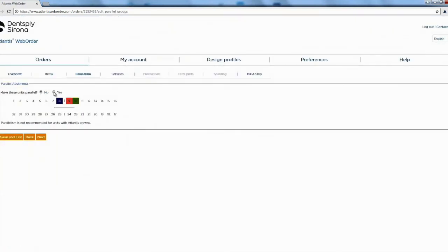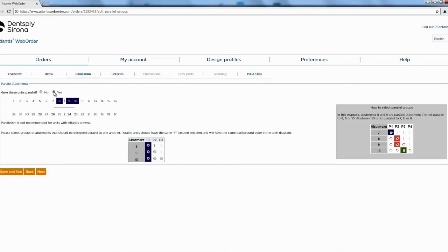All right next it's going to say do you want them parallel. If you want them parallel go ahead and hit yes.